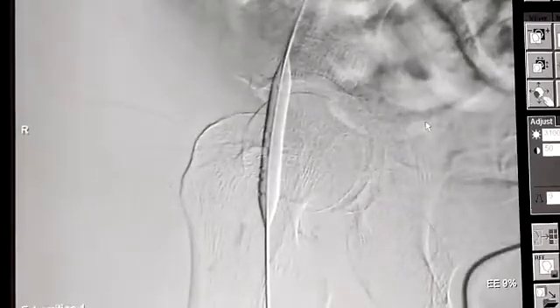So we decided to go with a balloon-assisted glue injection into the pseudoaneurysm. We deployed an 8x40 balloon and then checked whether this is sealing it properly, and we are very happy with the sealing. So we now go into the next step and target the pseudoaneurysm.